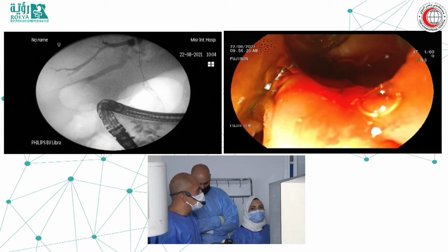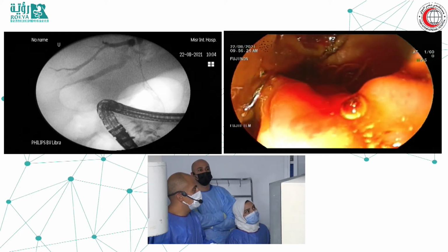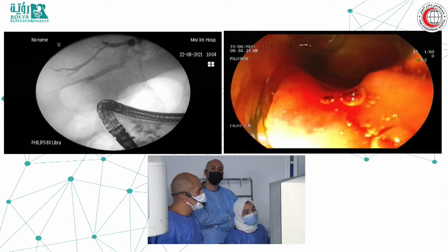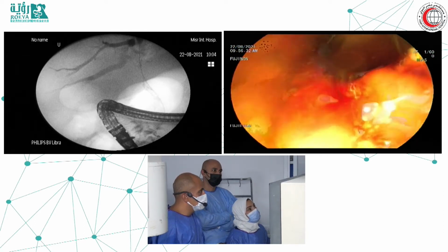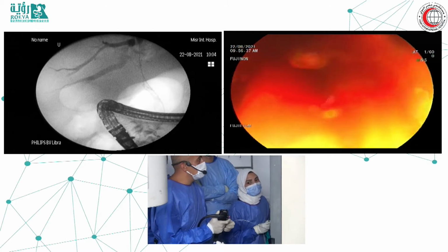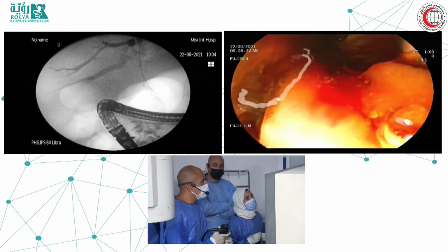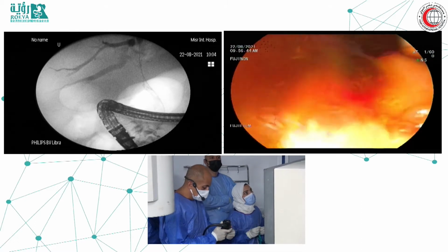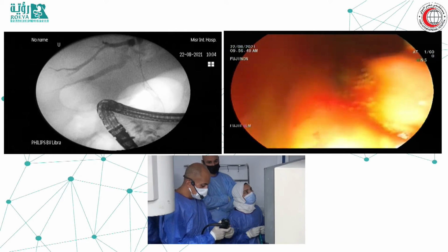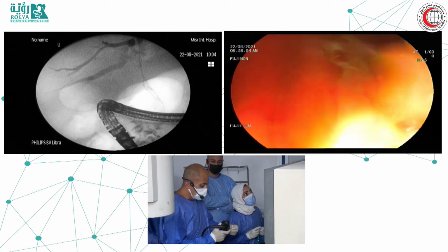So I will exchange. I'm also using this new guide wire from Boston Scientific, the Jagwire Revolution, which is very good sometimes in doing this right and left manipulation to go into the right biliary system and left biliary system. As you can see, I'm putting my patient in supine position. As I said, I'm from the Kramer school, so I always use the supine position. The patient is intubated. So we are exchanging now, and then I will put the Spy immediately.